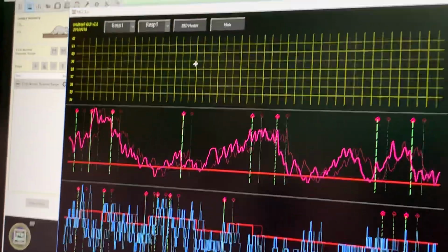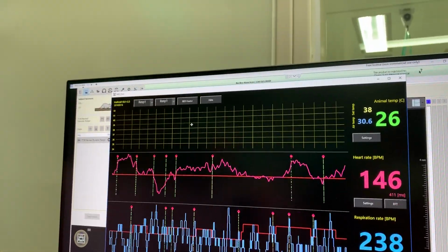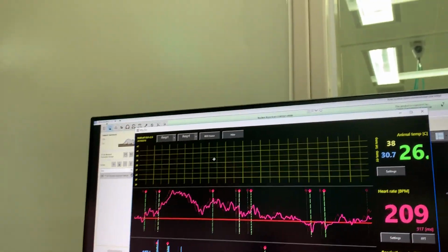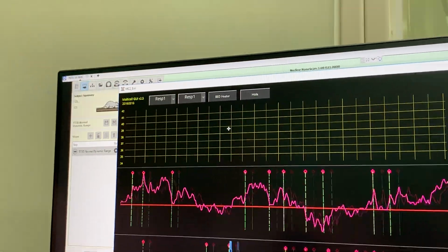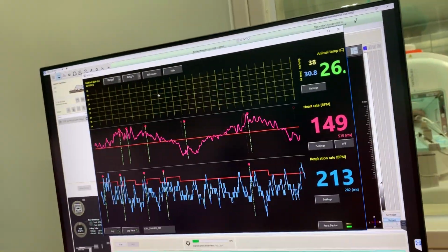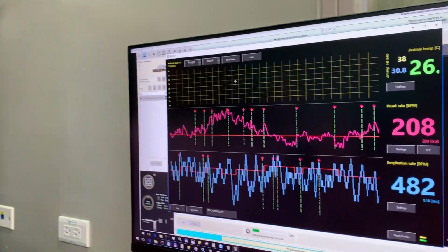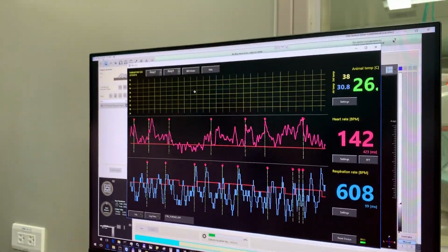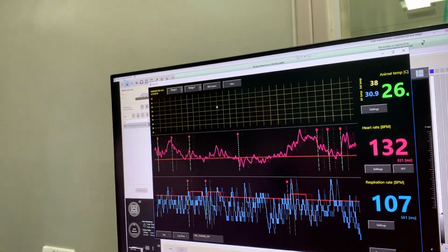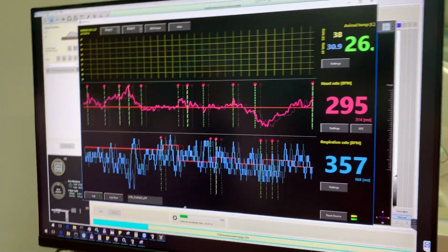What's the difference between respiratory 1 and respiratory 2, and ECG1 and ECG2? I think the reason is that there are hardware possibilities to collect more than one signal through different channels, but we use the first one. That's the only thing you have to remember.